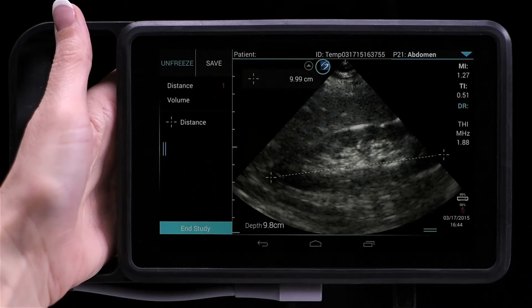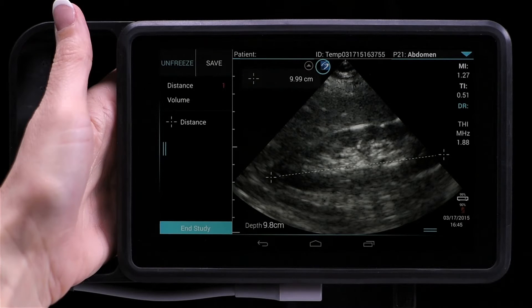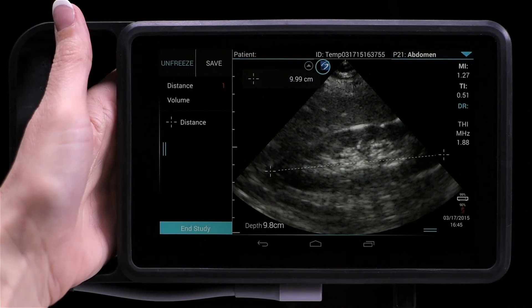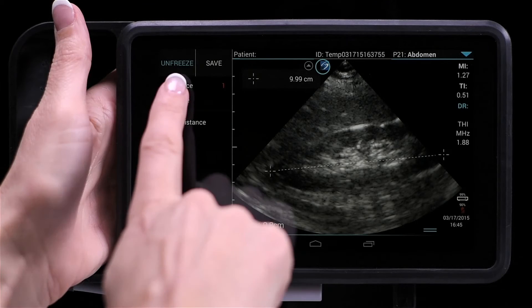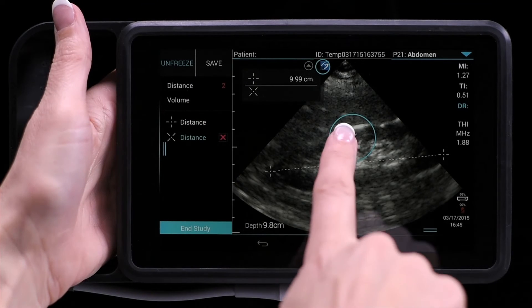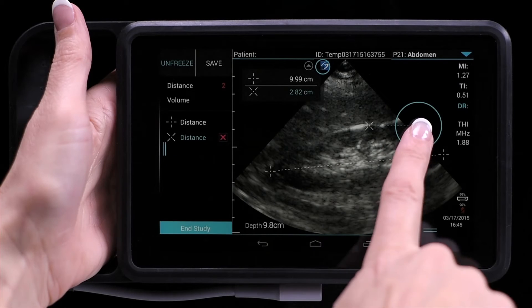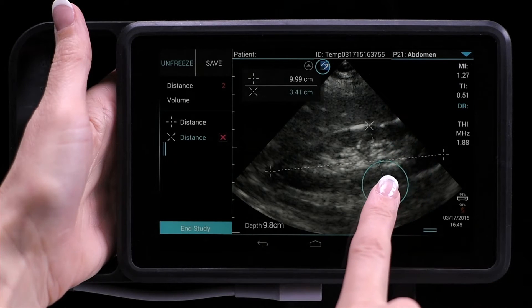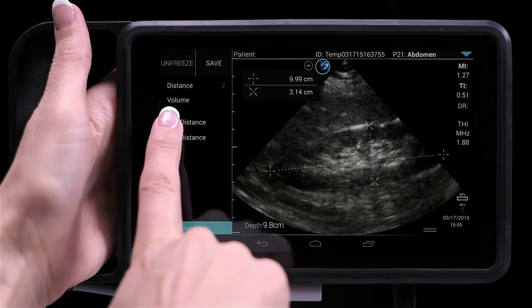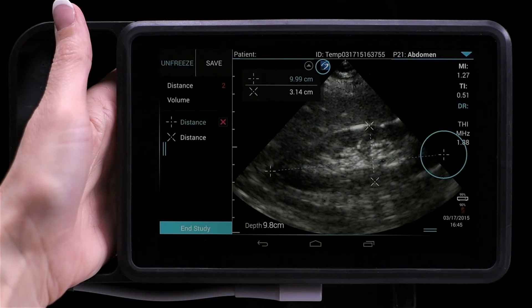To reposition a caliper, just touch and slide. To add an additional caliper, tap the measurement type and place those calipers on the screen. To delete a caliper, select the caliper you want to delete and then tap the red X.